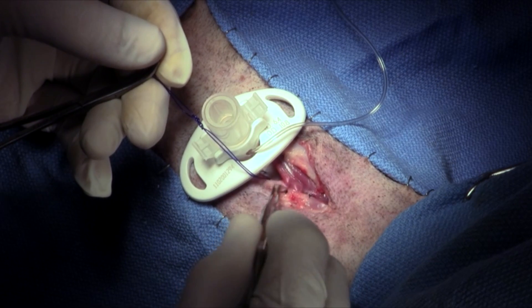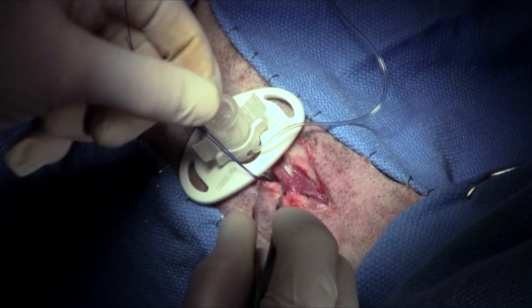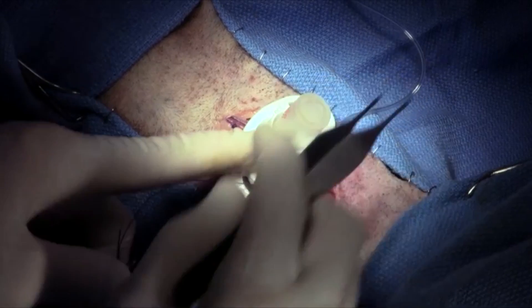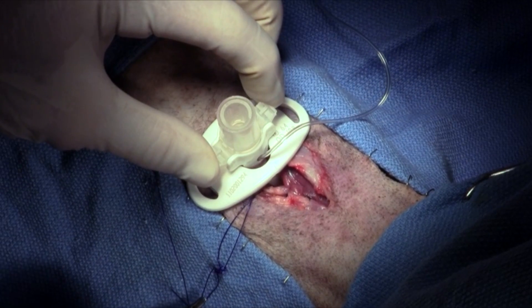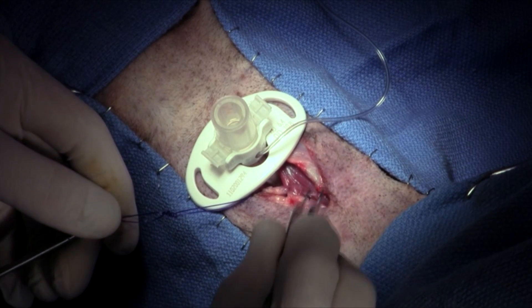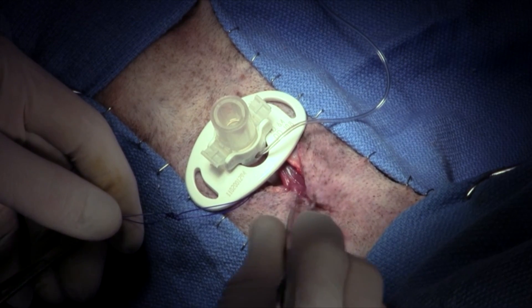The sternohyoid muscle bellies have been opposed with 3-0 absorbable suture. Notice that they have not been opposed directly around the tracheostomy tube placement — note the room around the tracheostomy tube cranially, which is desirable when the tube is removed. At this point, routine closure of the skin can be performed; in this video, surgical staples are used.